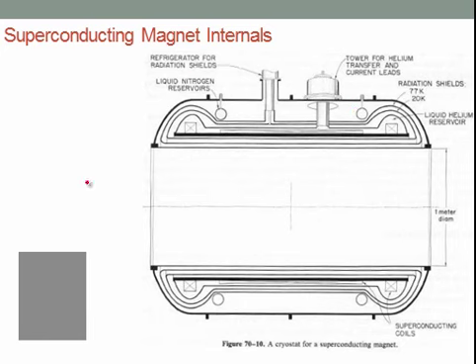But for a design like this that does not have a cold head, you will have liquid helium boil off, and therefore you'll have to keep filling the helium about every 3 months or so. Liquid nitrogen you need to fill about every 2 or 3 weeks. So it is labor intensive.